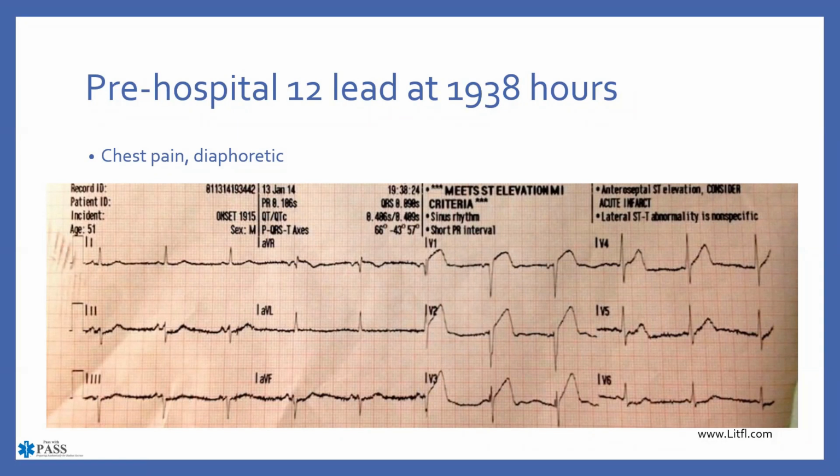So I have at least an anterior septal wall infarct here. This is okay. As long as the patient has a pressure and all that stuff, I can start treating them with MONA or FONA. So I give them either morphine or fentanyl, oxygen, nitro, and aspirin, depending on allergies and everything else that we should be asking. The patient is complaining of chest pain and has some diaphoresis.